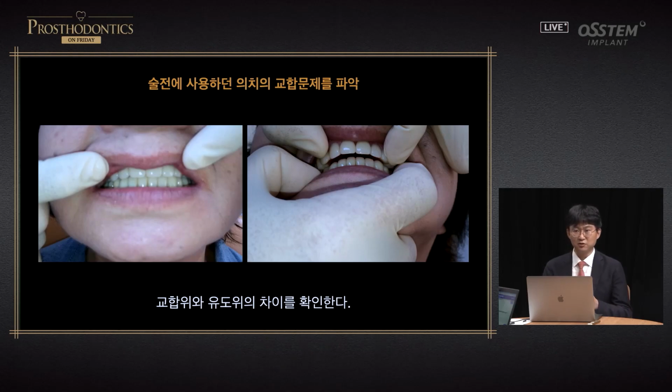Some had discomfort in chewing. There were other problems, so they want new dentures. If you observe old dentures, it can be very helpful. Some use the old denture for chewing pretty well and it is stable, but some experience some discomfort.